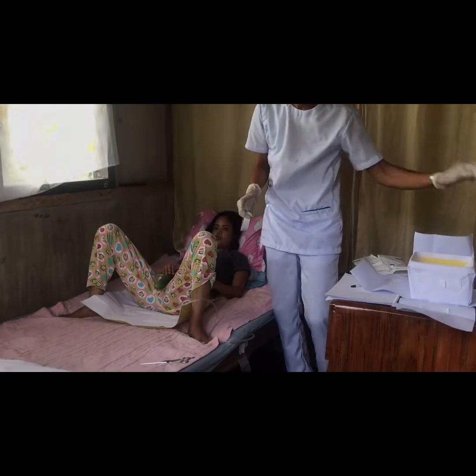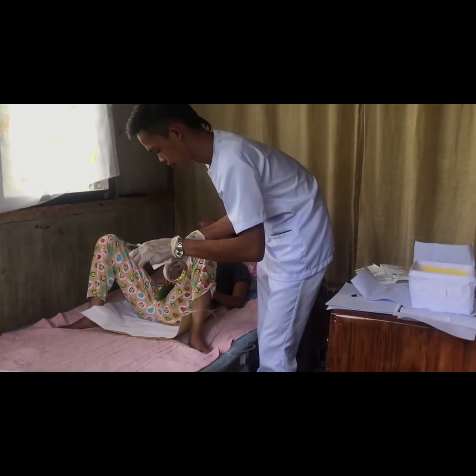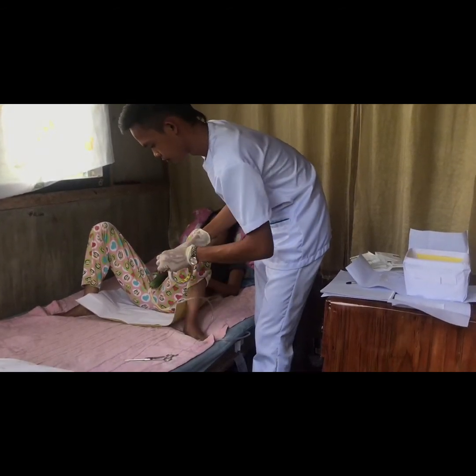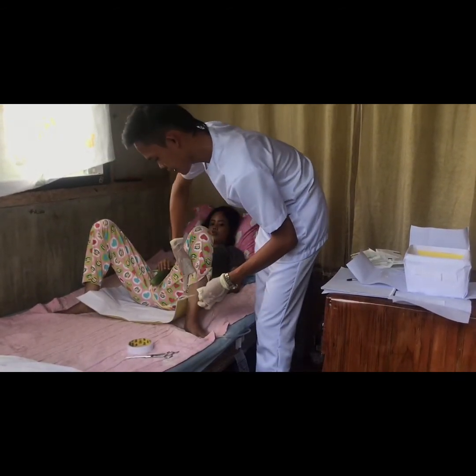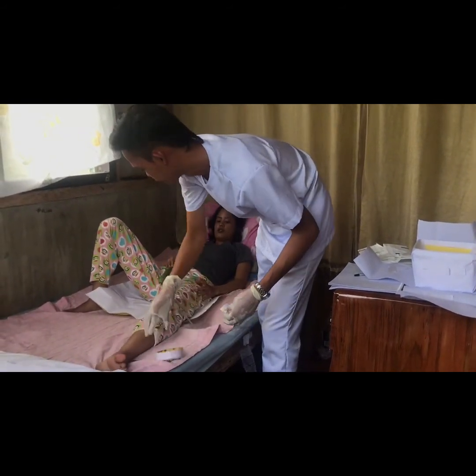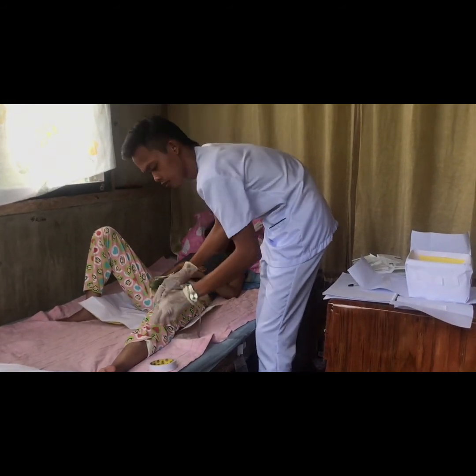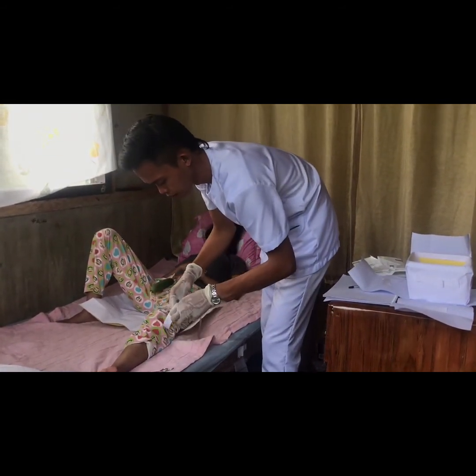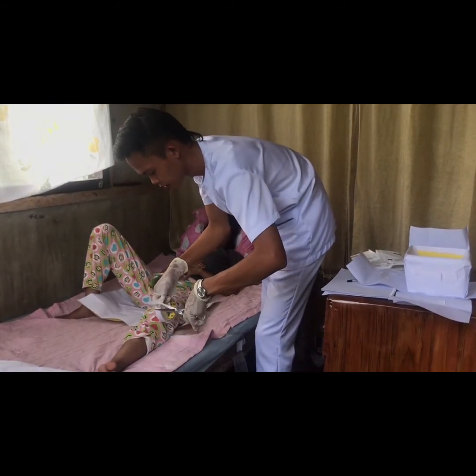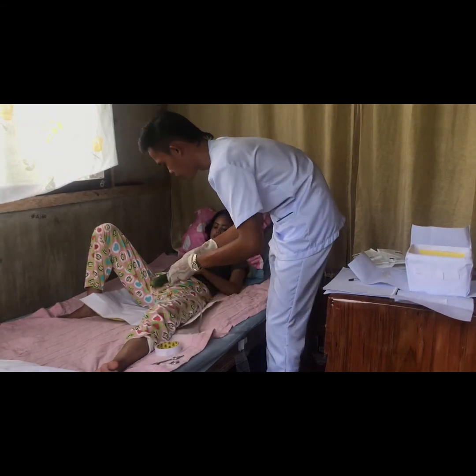Okay. Okay. Please straighten your leg. Are you okay, sir?